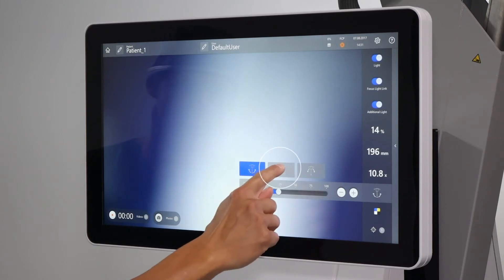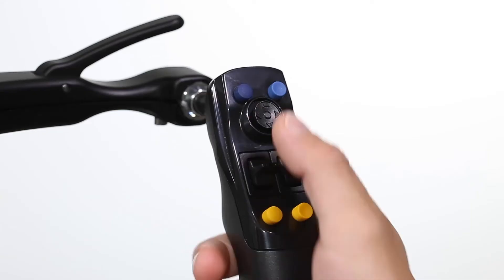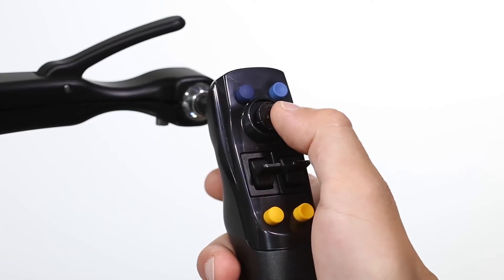With the Lateral XY Stand mode, you can make smaller movements in the XY plane. You can control the movement with the XY joystick.